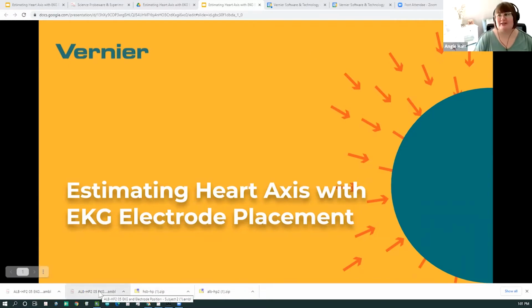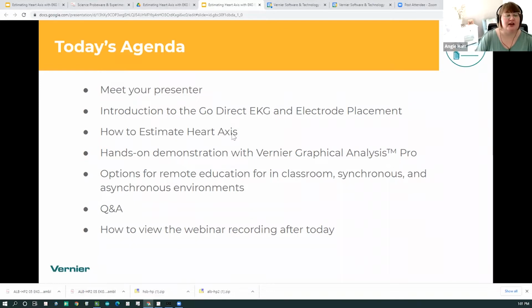In a few moments, I'll pass it over to John and Sarah, and they'll do an introduction to the EKG and electrode placement experiment and go over some of our other options, including a demonstration of Graphical Analysis Pro. So I'll pass it over to you guys.